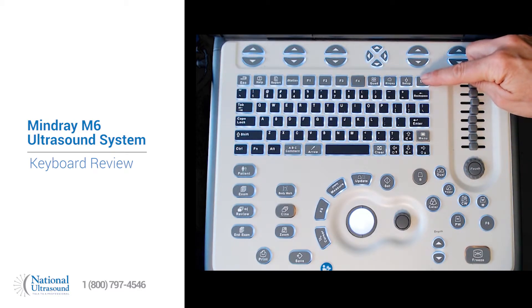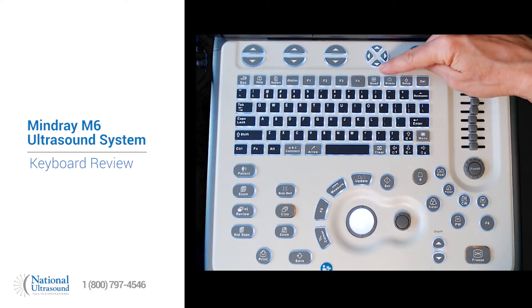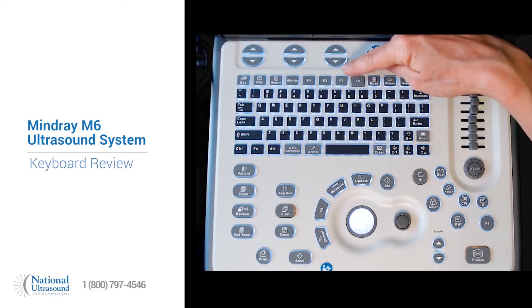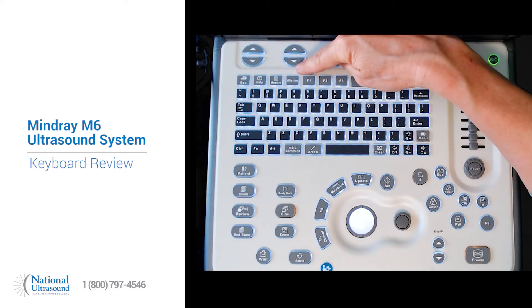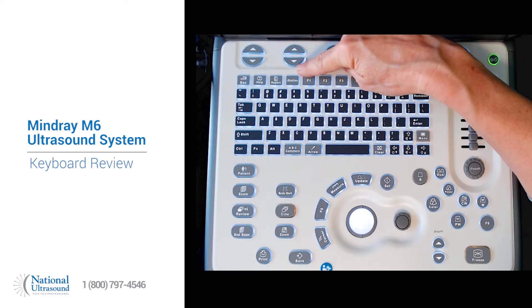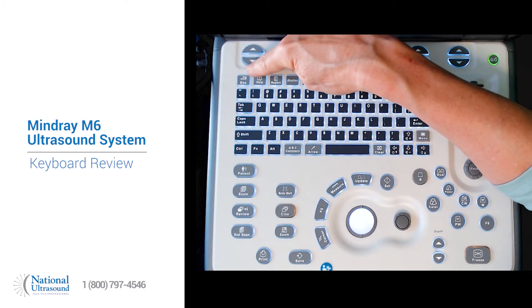Here is a delete button, set up to get into configure the system, biopsy, quad. The F1, F2, F3, F4 are programmable. iStation will take you into the hard drive of the system to see previously stored studies, report, help, and escape.